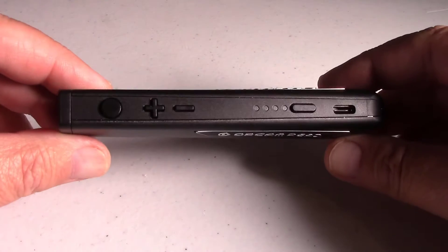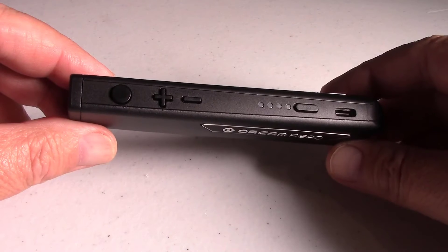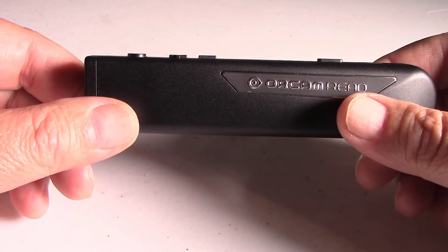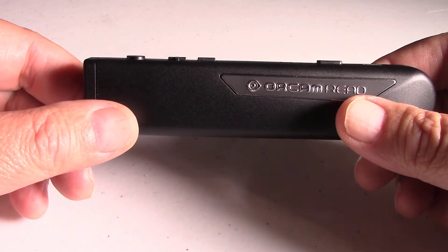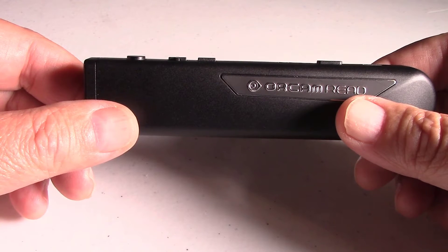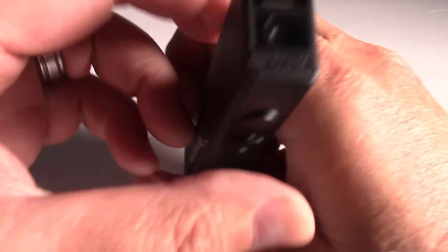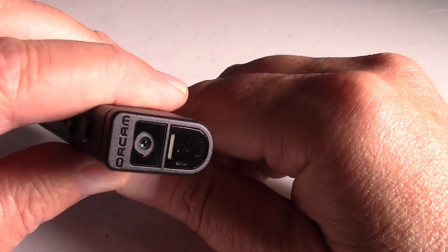OrCam Read is a device for someone who is print impaired. You basically take a picture of text — whether that text is printed or text on a digital screen — and this will read it back to you. Looking at the front of this, that's the camera. It's a 13 megapixel camera.